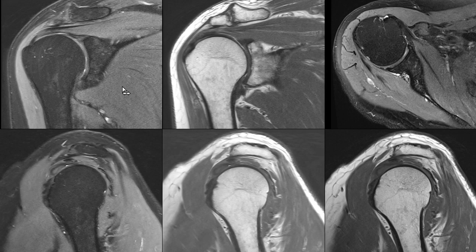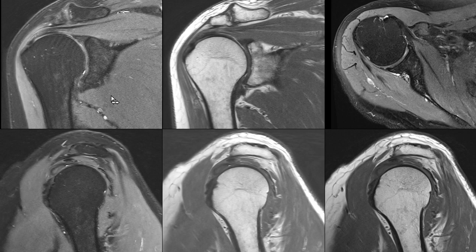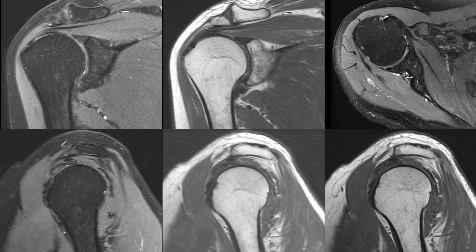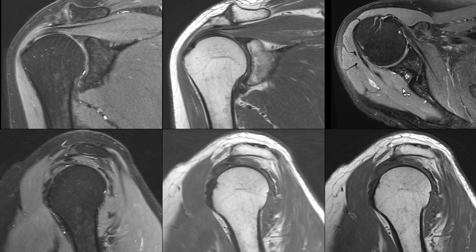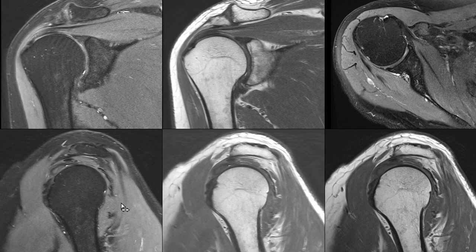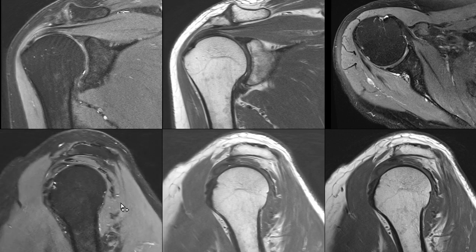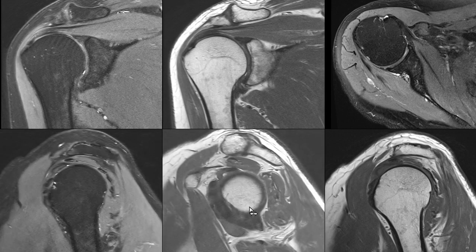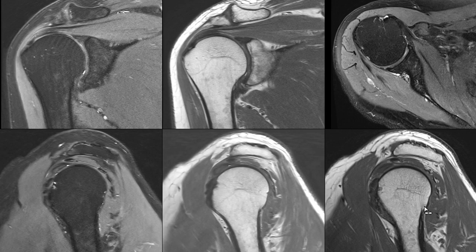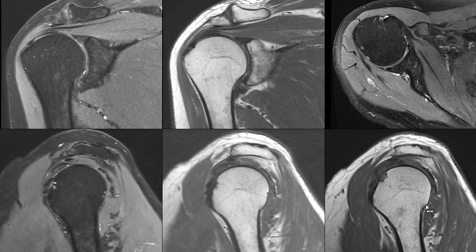A brief overview of his examination. We have here a PD fat-saturated coronal oblique sequence and a corresponding non-fat-saturated image. We have here a transverse PD fat-saturated sequence. We have here a sagittal oblique PD fat-saturated image and the corresponding non-fat-saturated sequence, and we have a T1-weighted sequence also in sagittal oblique.